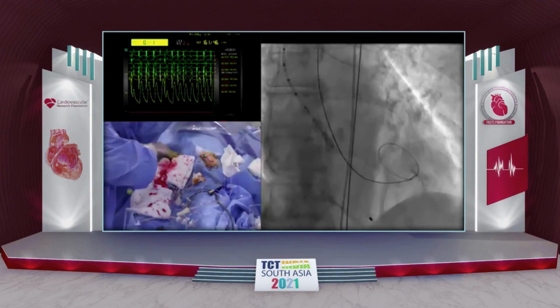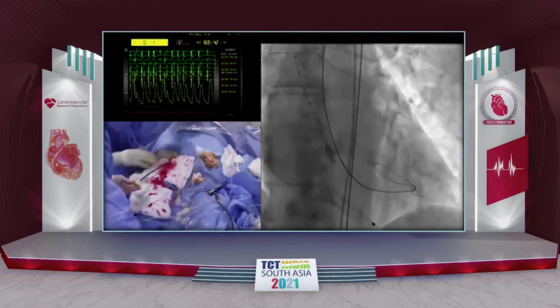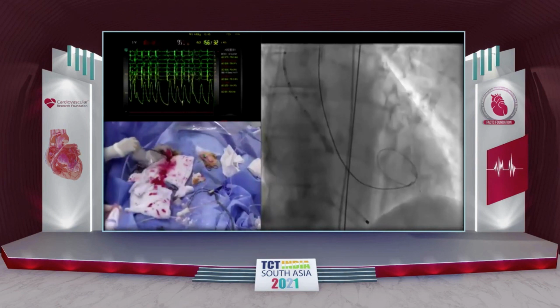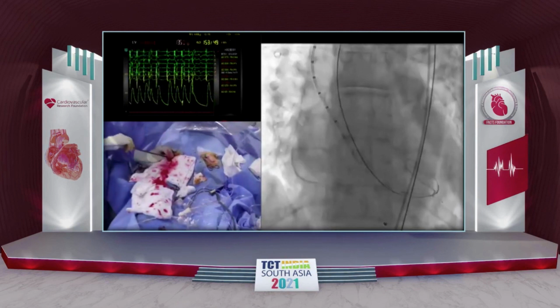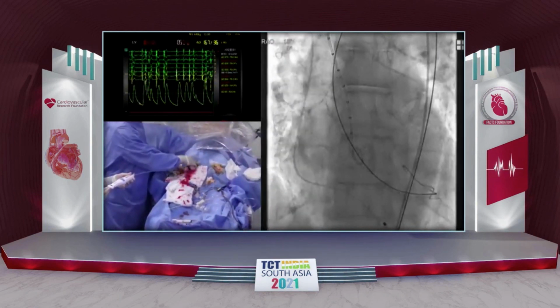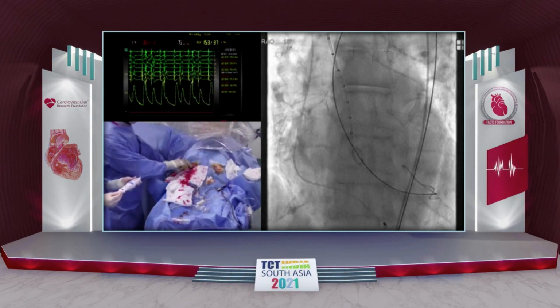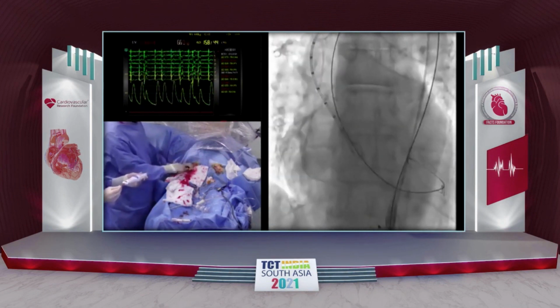So we're just advancing the Navitor delivery system with the Flexnav system. All of that from there to there is just hydrophilic coated. Okay, so Andrew is just going to rotate it 360 while I advance it in. And that's it, it goes. I'm not kidding. There are times where I've advanced this valve, and Andrew would have done the same, and you feel, okay, have I actually gone through something that I shouldn't have? But actually, it's so flexible. It's amazing, in terms of the technology.